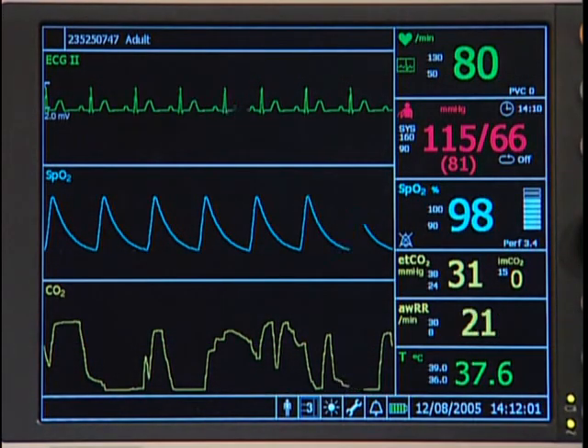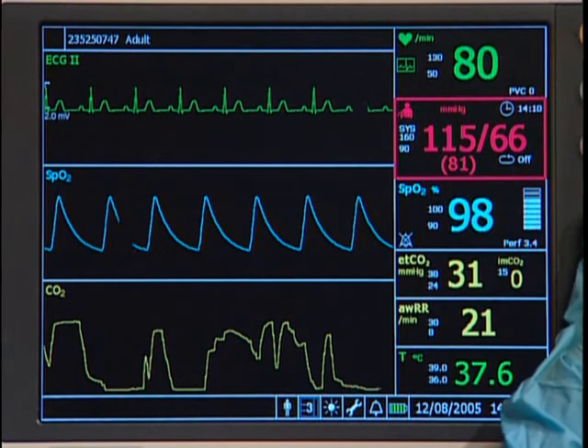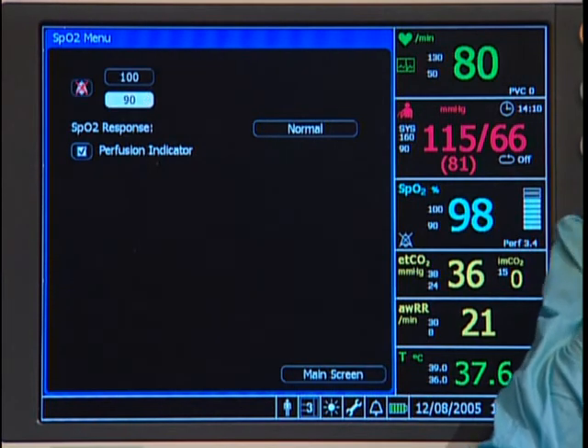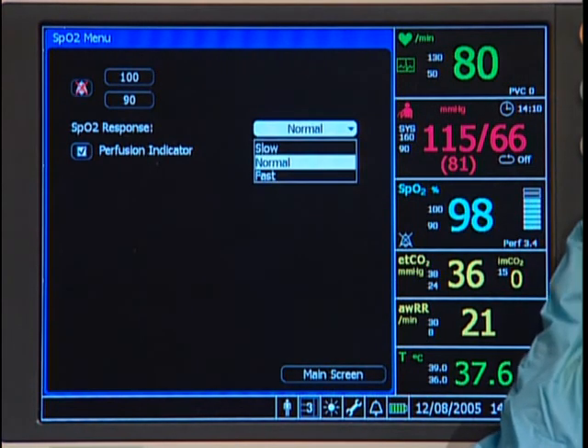To access the SpO2 setup menu, highlight the SpO2 numeric pane and select it. Use this menu to change the response time and the high and low alarm settings.